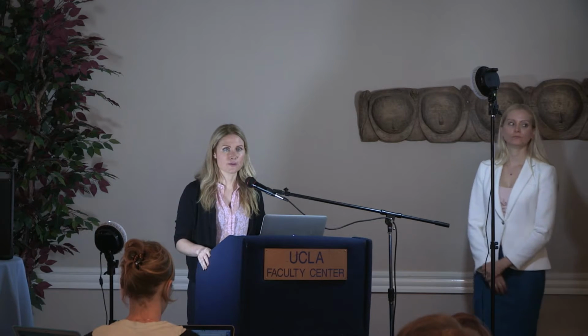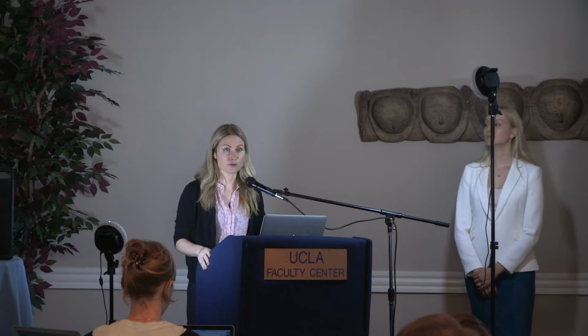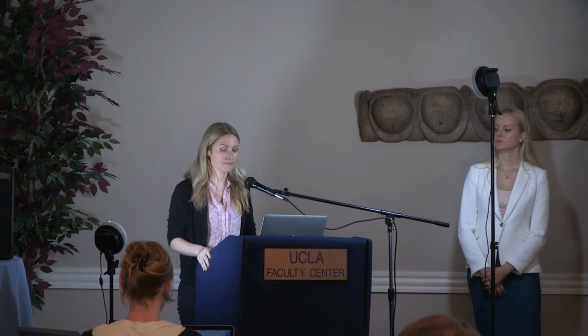So if you have something that's a little bit more coarse, it's a lot easier and faster to make the estimates. And of course, if you have more measurements on the scalp, those are the knowns, if you will. And so if you have more electrodes on the scalp, then you're given more information. If you have, say, 30, it's hard to make very specific estimates. I've heard a lot of people say 100 is good, something 100 or more.